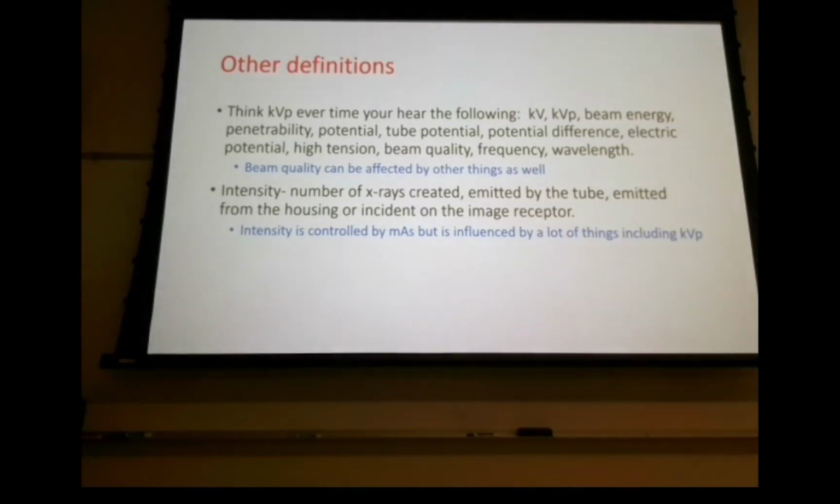Now, I said something on Wednesday that seemed to indicate that 30 kVp wouldn't penetrate much. And it will, much more so than what you think it will. In the context of what I was saying, if we set a 90 kVp X-ray beam, our average energy is 1/3 of that, which is 30 kVp, right?